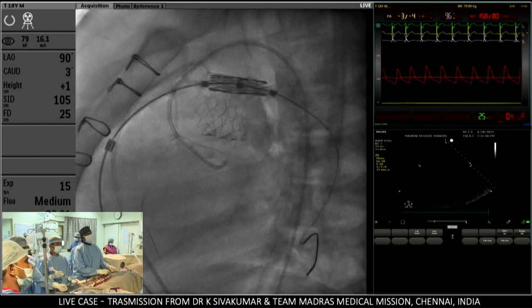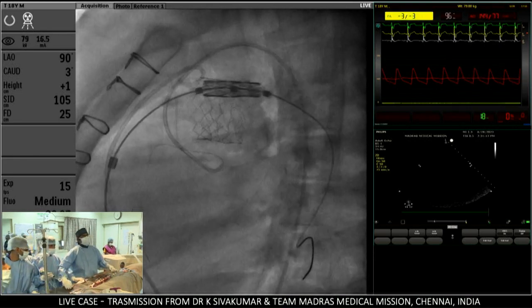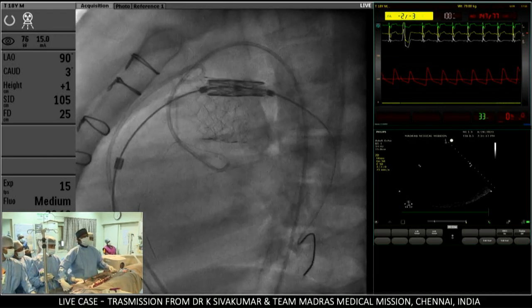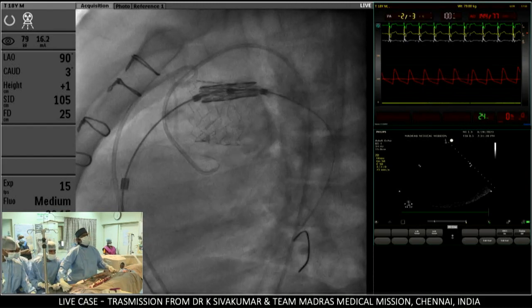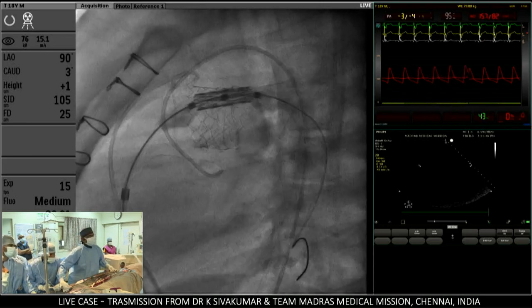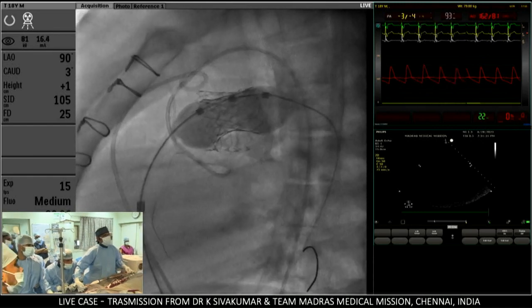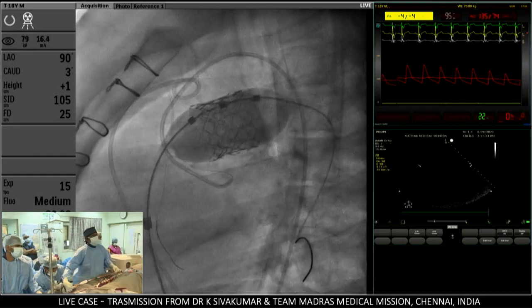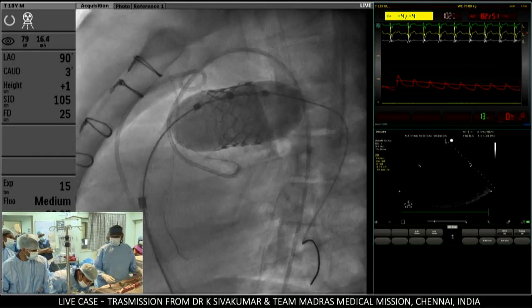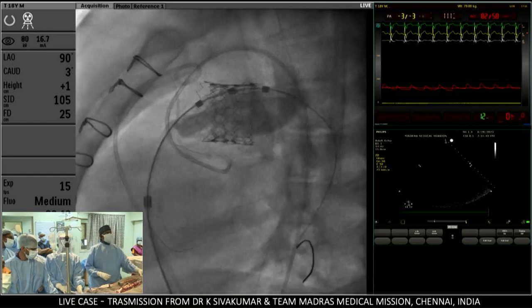Now as he is inflating, I'm going to adjust the position. What French introducer did you use? It's similar to an E sheath. This is called the Python sheath. Can you keep inflating? Then I will adjust. Python, the snake, not the Titan submarine. Keep inflating. Inflate, inflate, full, go complete, empty, rotate, full, deflate. He's squeezing. Yep. Okay, well done.